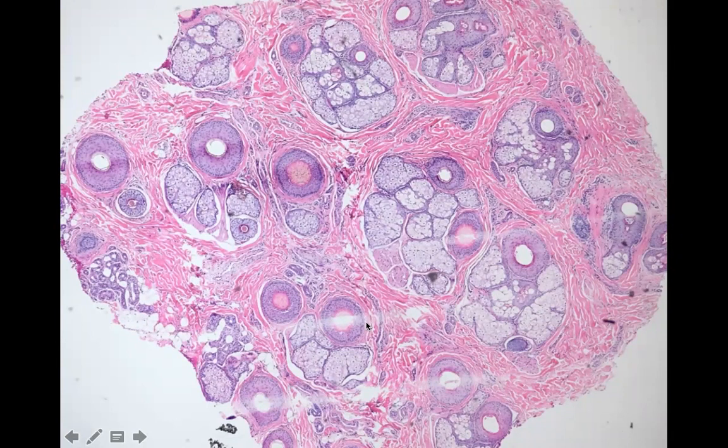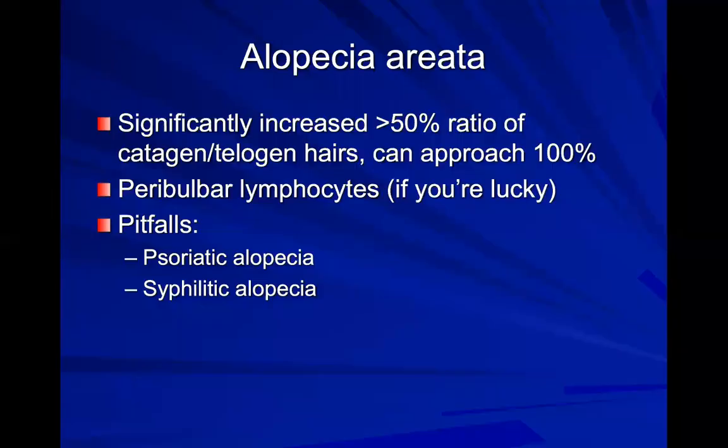We have about 7 telogen/catagen hairs that we can see from low power, right? We're starting to see that little kind of starbursty look in the middle, or this wiggly hair around the side. So 7 out of 24, you're getting close to 30%. And that is increased from the 15%, right? So this person probably has telogen effluvium.